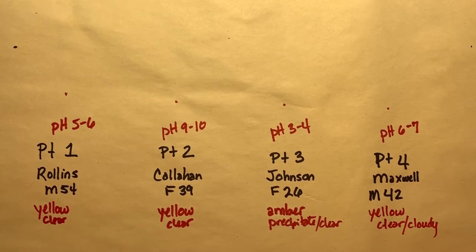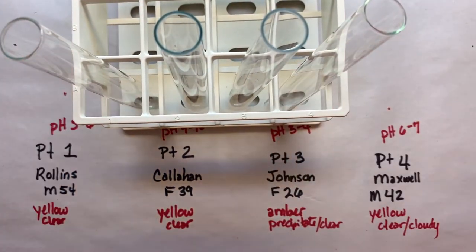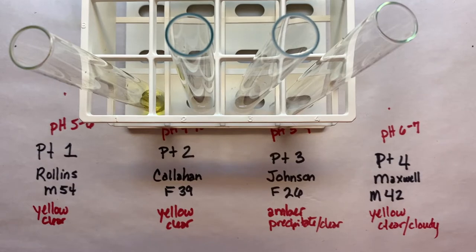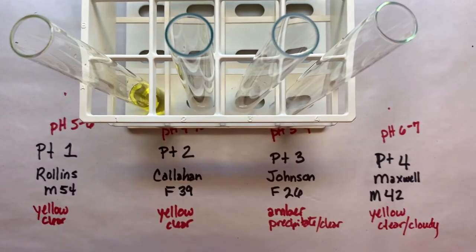Okay, so again, we've got 4 tubes, one for each patient. And I'm going to add 3 milliliters of urine, so that's 3 pipettes worth, since each of these is a milliliter. And again, remember not to mix up your urine samples by mixing up your pipettes.